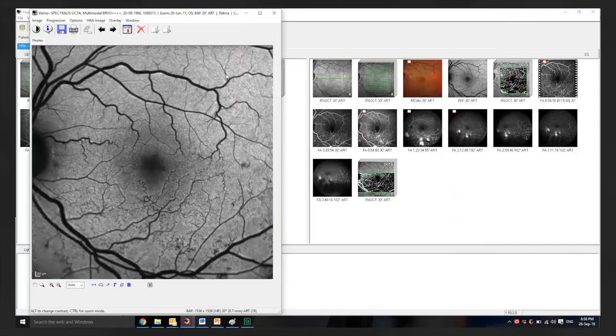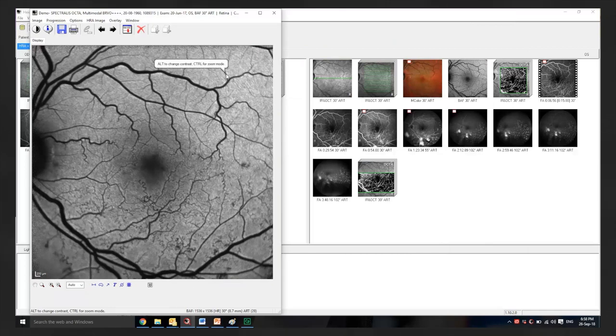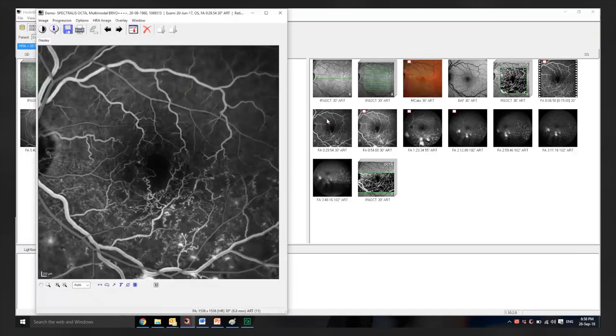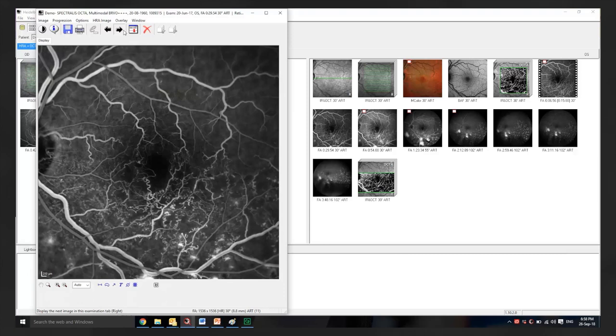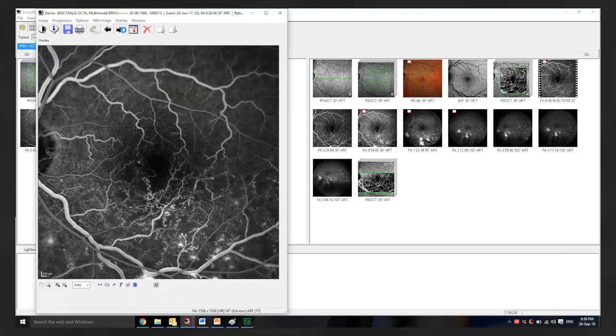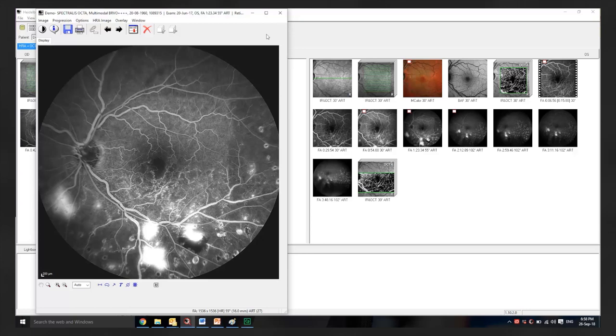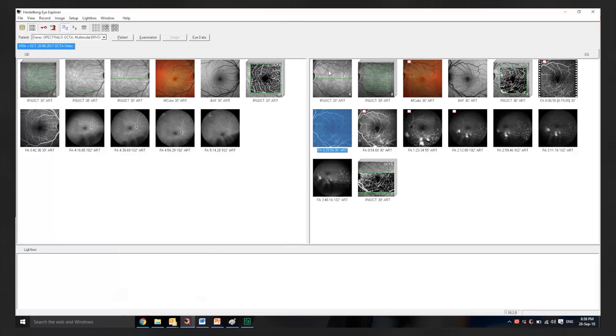Blue peak autofluorescence is also complementary and may give information about atrophy or pseudo-reticular drusen. Conventional dye-based angiography is particularly useful to give information about the blood retinal barrier. Breakdown of the blood retinal barrier is identified on fluorescein angiography through leakage but OCTA does not identify leakage. It's important that the small field of view captured with OCTA may miss key clinical characteristics. An example of this would be peripheral neovascularization due to diabetic retinopathy.